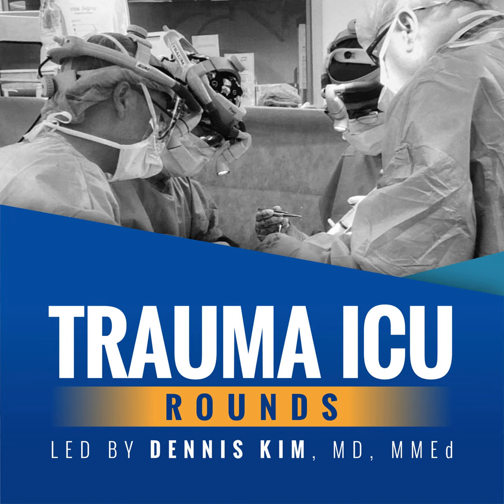One is spontaneous breathing, like we talked about with the T-piece trial. Then there's CPAP and pressure support ventilation. For the purposes of the remainder of the talk, we're going to really focus in on pressure support ventilation because this is very commonly used in preparation for potential extubation.